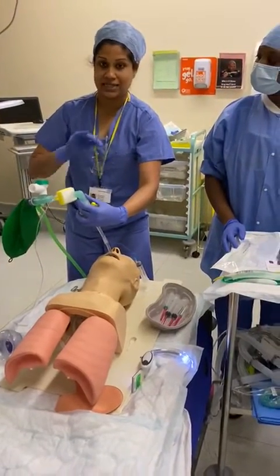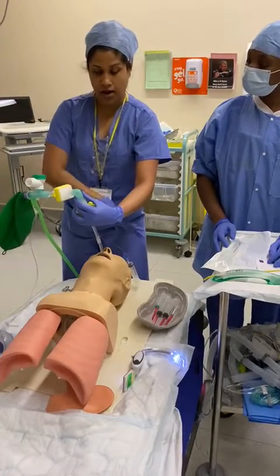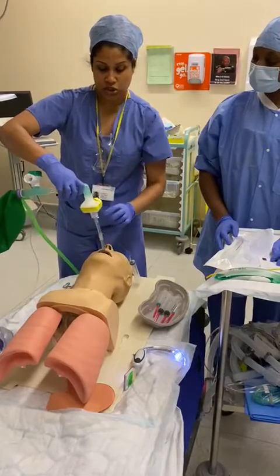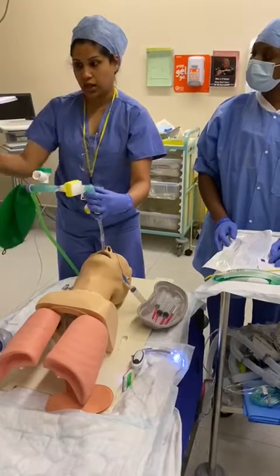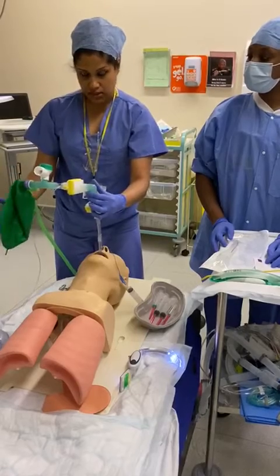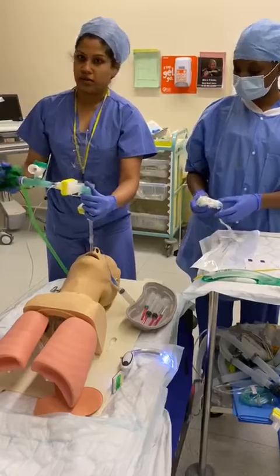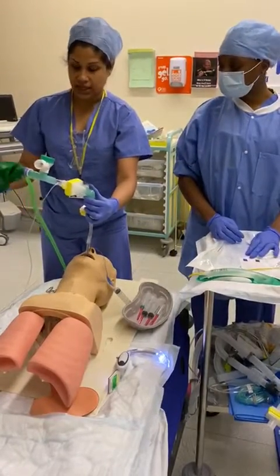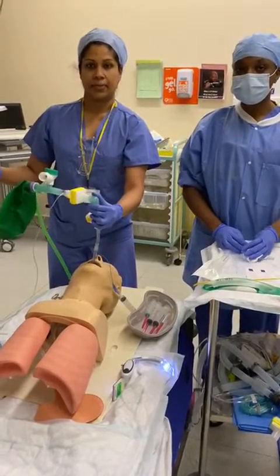Once the muscle paralytic is in, the first thing you have to do is make sure that you get the tube in, cuff up, clamp on, attach to oxygen, clamp off, ensure the cuff is up, and then bag the patient and look for capnography and chest movement. Once this is sorted, the next thing you have to think about doing is transferring the patient. And there's a whole set of maintenance drugs that's available in your intubation drug set for you to enable you to do that as well. Does that make sense?